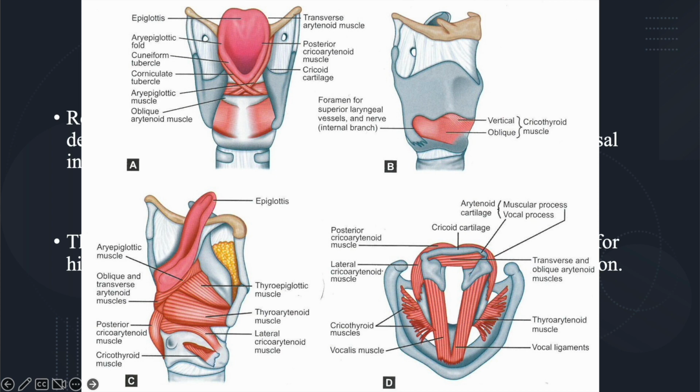We'll use the mouth for the example. And now you have your guide out of the mouth, where you can get your endotracheal tube, and similar to a bougie, you pass it over the guide, and now the endotracheal tube just follows the guide down the epiglottis, past the vocal cords, into the larynx, and then since it's past the vocal cords, you can inflate the cuff, and you have access to the trachea. So it's similar to that, just in the opposite direction.